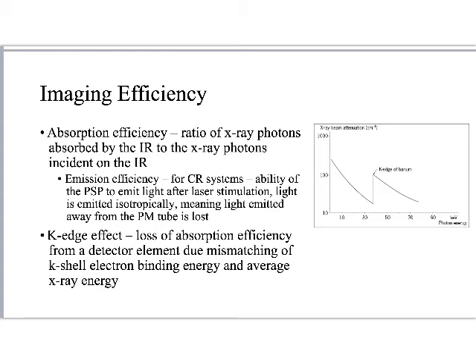And then the second thing is the K-edge effect. They're both very different things. So I'll talk about one and then I'll switch gears and I'll talk about the other. So for the first, the absorption efficiency.